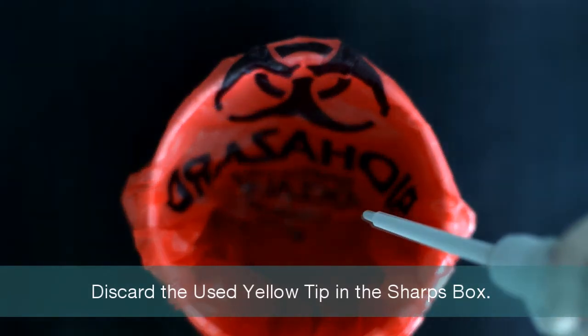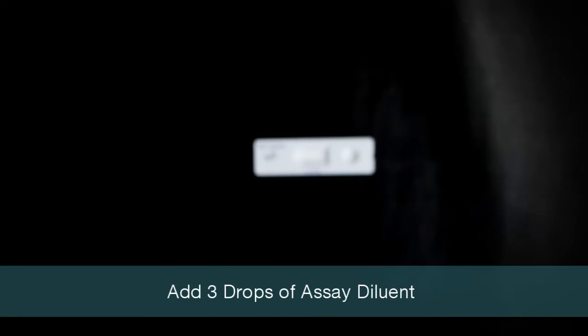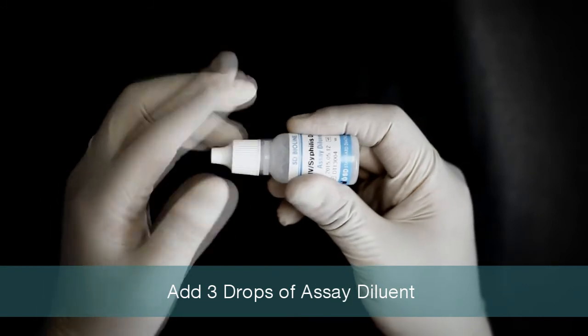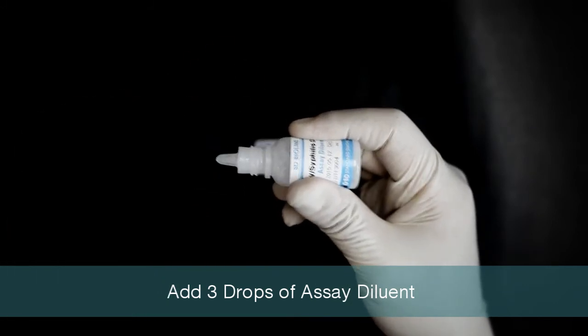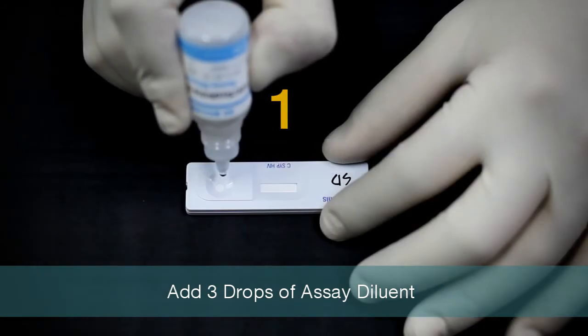Discard the used yellow tip immediately in the sharps container. Add three drops of buffer into the sample well: one, two, three.